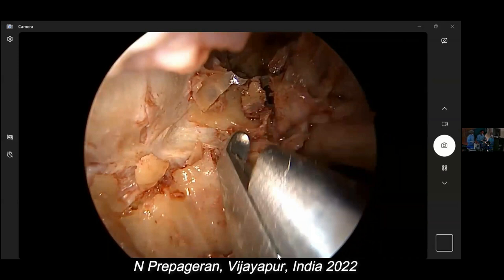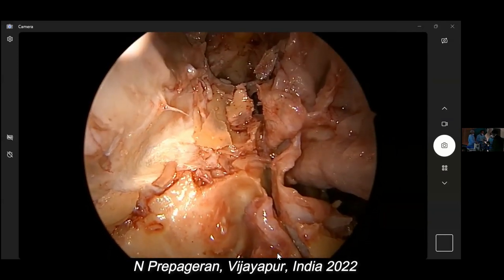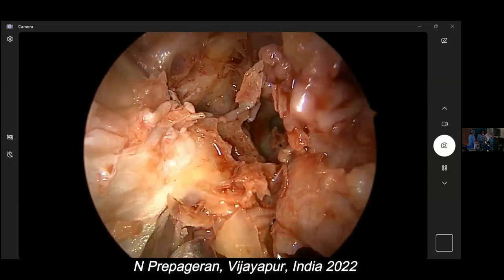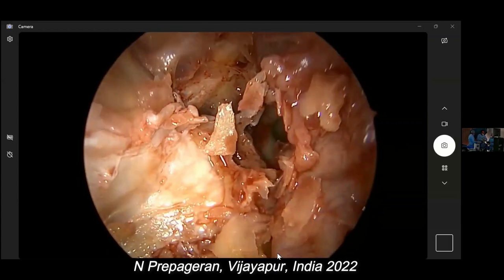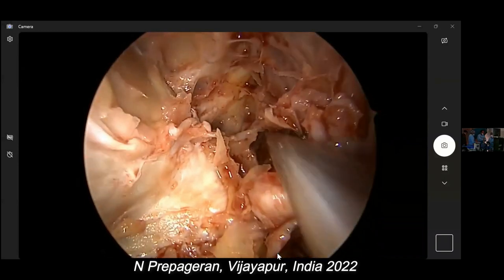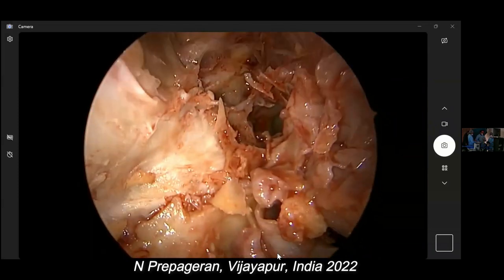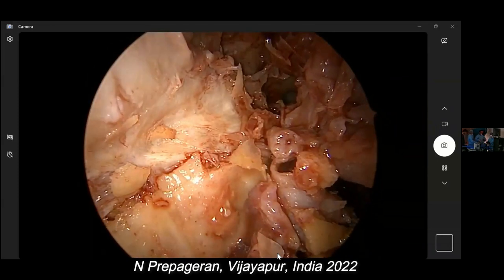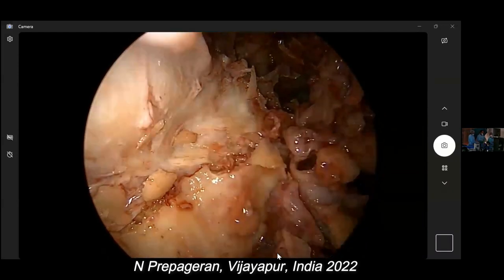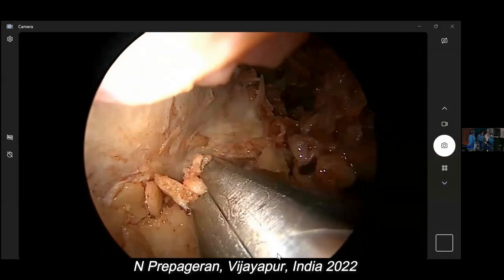I'm going to now remove this bone. So this takes us to the lateral wall of the sinus. In this case, it's not going to be easy because his sphenoid sinus is not very well pneumatized. I can already see the infraorbital nerve. Now I'm going to go down and remove as far low as I can.